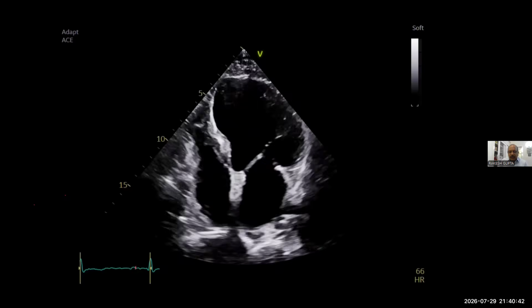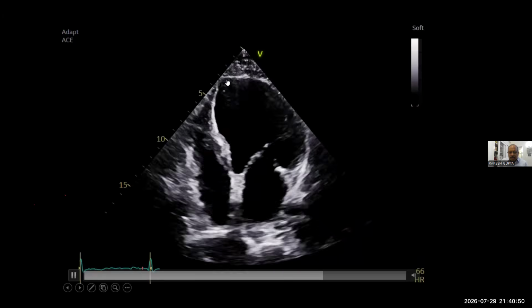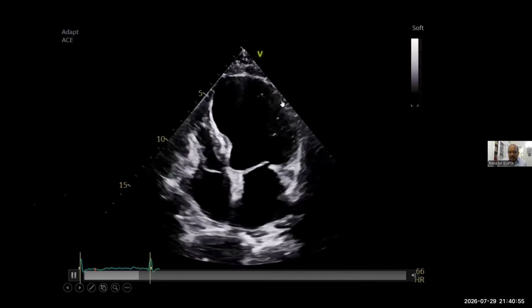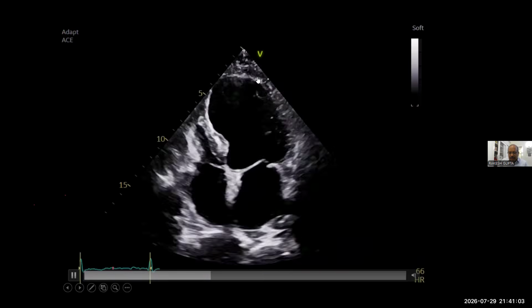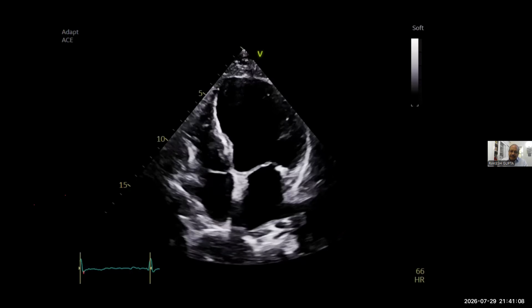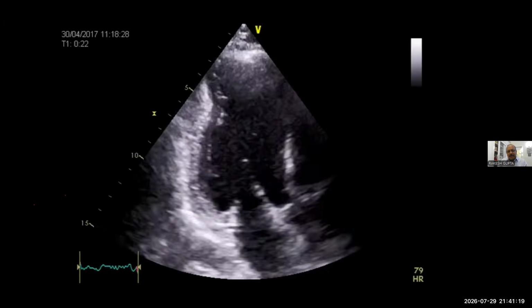Now, another example. Look, apical septum along with apical lateral wall is almost akinetic, thinned out, and hyperechoic. Mid and basal lateral wall is normally contracting. Basal septum is normally thickening, but mid and apical septum and apical lateral wall along with apex is akinetic. There's hardly any thickening and it is virtually thinned out. Any segment which is less than 6 millimeter in size is akinetic, non-viable segments.